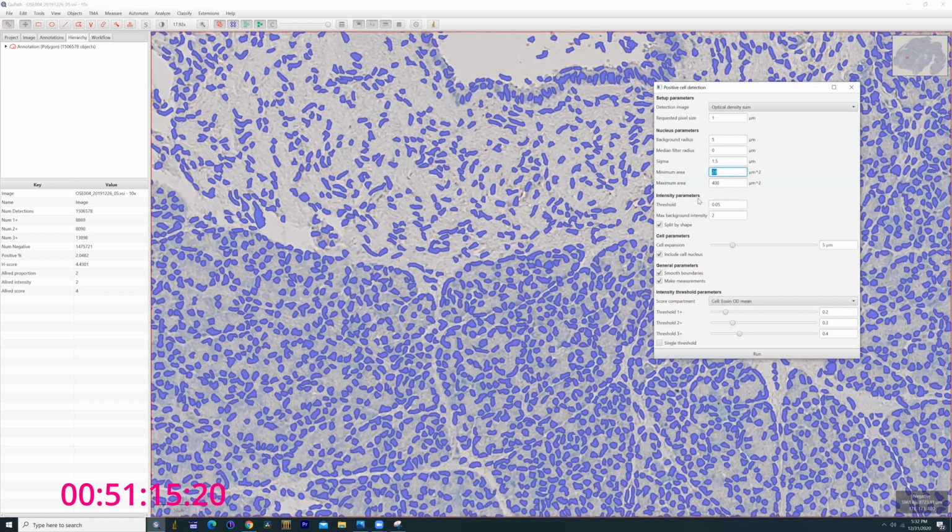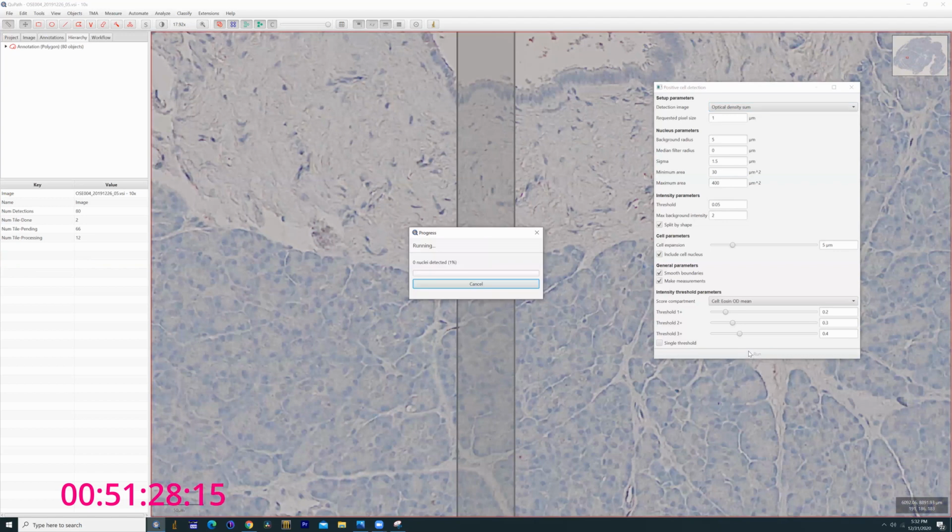We'll play with this a little bit more. I might as well finish this off for the tutorial. So let's try pushing this up to 30. We saw 50 is too high. Let's try 30. Most of these artifacts are pretty small, so I'm hoping that they will essentially disappear into the background.